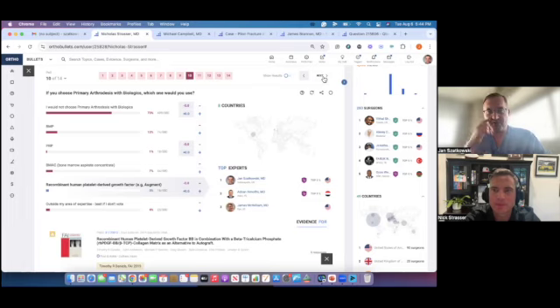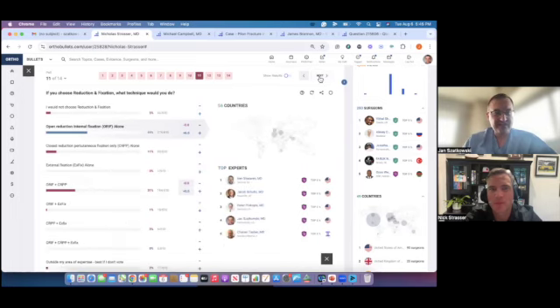Right, and I don't use a lot of biologics in the foot. Maybe that's why I have some non-unions. I don't know, but it's also about keeping it there. Do you ever use BMP or anything like that for midfoot fusions? I have used it intermittently, but most of the time when I'm doing a midfoot, I'm going to take cancellous autograft or use something off the shelf, not necessarily BMP. I just wonder where you put the BMP, because your incisions are small.